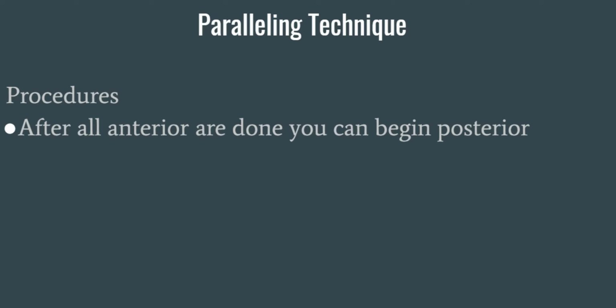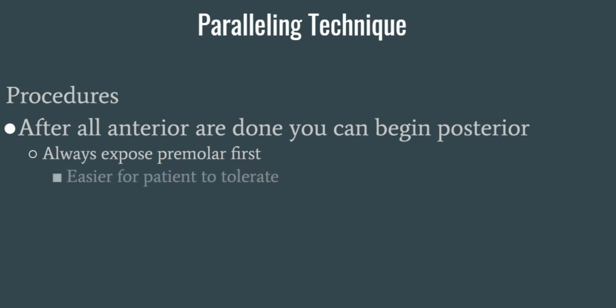After all the anterior are done, you can begin with the posterior teeth, and it's recommended that you expose a premolar first. Again, it is just easier for the patient to tolerate, and it helps them get used to that film placement in their mouth.